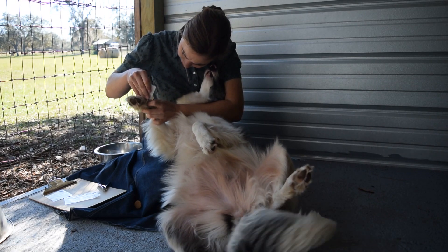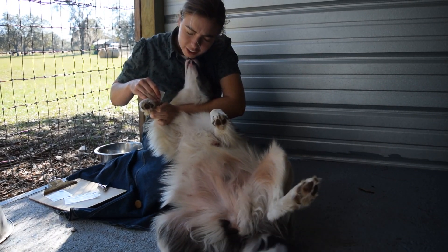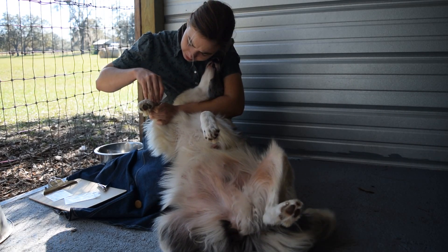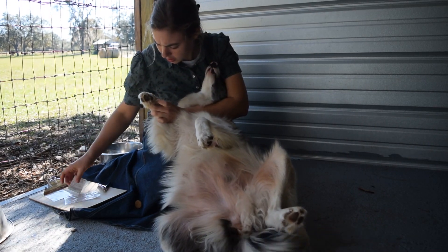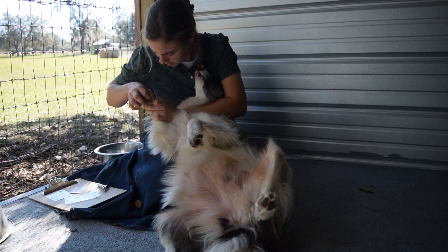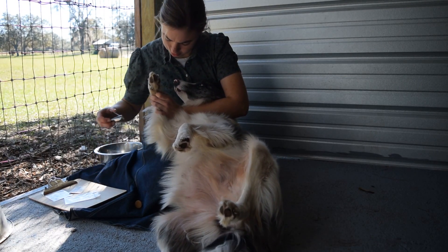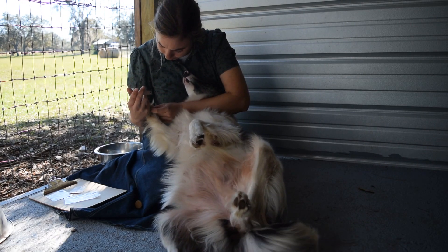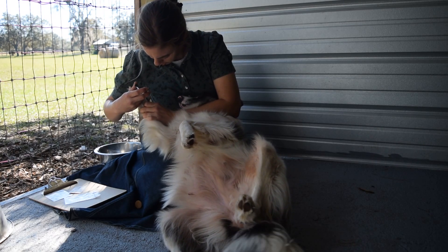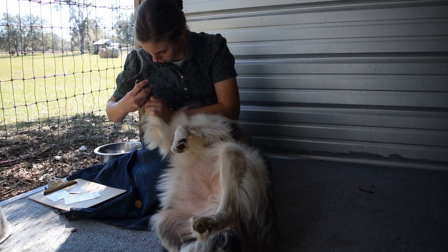Now I've got a little spot of blood — not really enough. The bummer is I'm going to have to cut that down even a little bit more. She's not going to like this. This is one of my least favorite parts about raising dogs; I don't like having to hurt them for this.